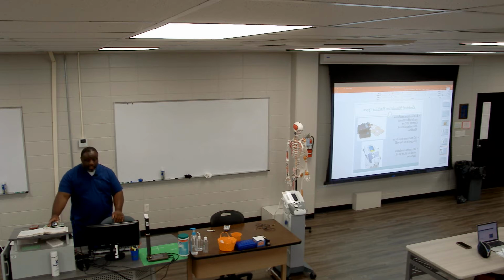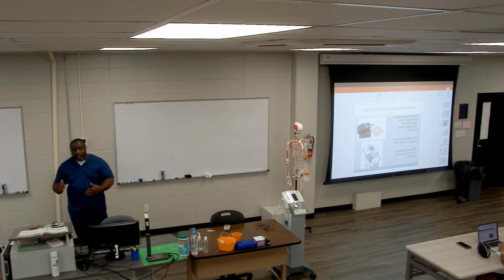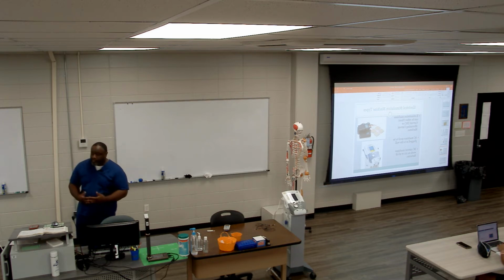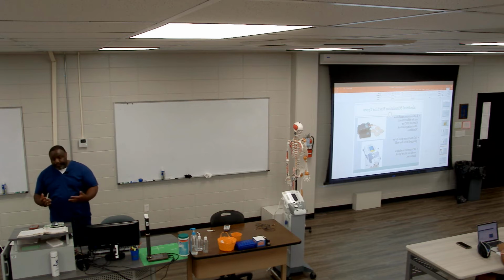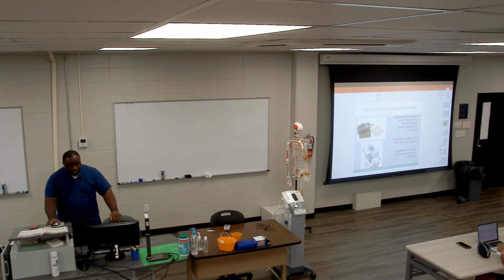So again, E-Stim machines can be either direct current or alternating current machines. They're usually not both, so it'll be one or the other. We'll play with both here in the class.